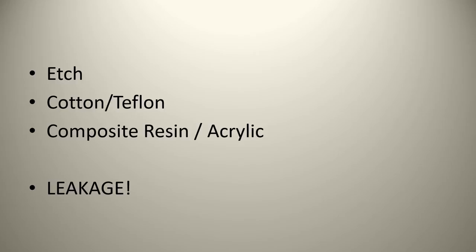There's the option of basically putting either cotton or Teflon, or some people use gutta-percha, some people use impression material, some people use wax. My personal bias, I like using something like Teflon, so polytetrafluoroethylene. And the main reason for this is it's not going to rot inside the chamber if it was the case that you do get some leakage.